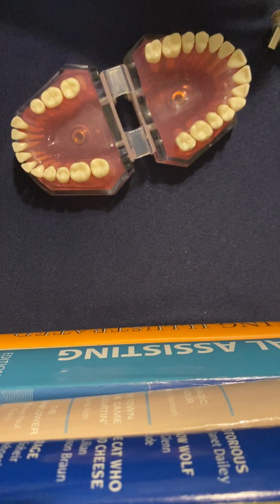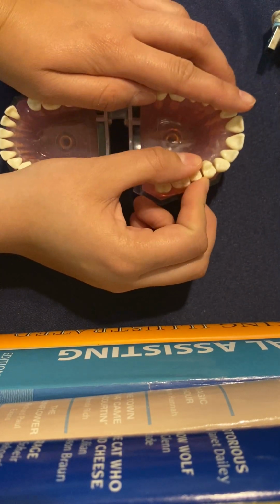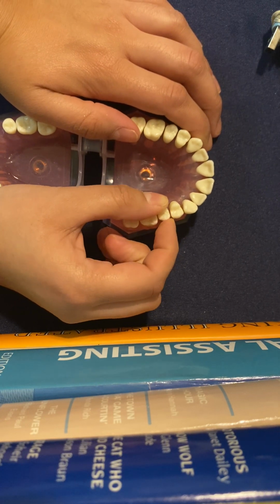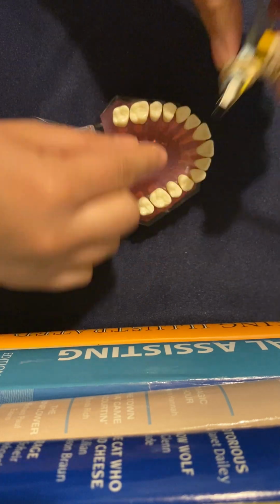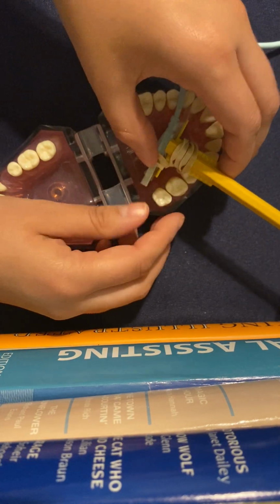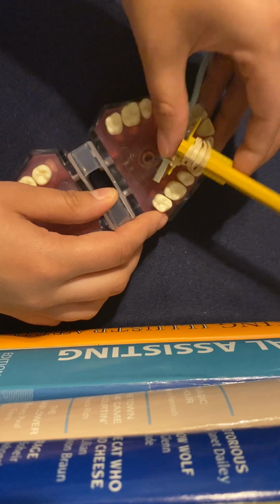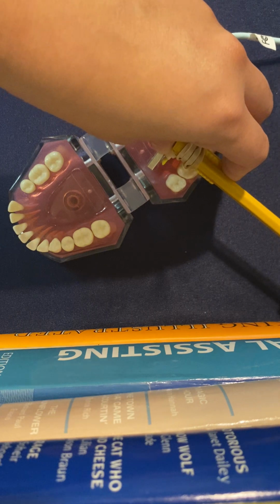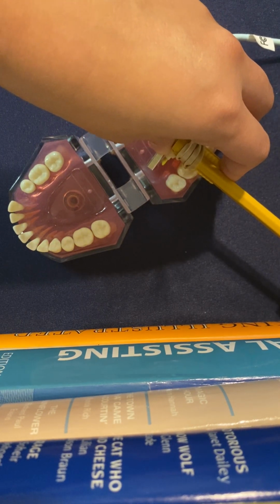So now we're going to do the maxillary left premolar. So we're going on this side. You're going to want to center it on the second premolar. So this, am I grabbing the right one? Yep. You want to get in that sweet spot right there. You're using this posterior tab. Get that midline, try to get parallel with that tooth. And the teeth that you're going to want to see in this one are the distal of the canine, first and second premolar, first molar, crown, apices.